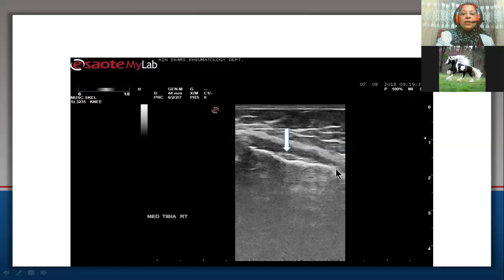On musculoskeletal examination of her upper medial tibia, there was severe tenderness on sonopalpation, together with appearance of periosteal elevation, which may point to the presence of periosteal avulsion in this female with systemic lupus erythematosus, or even presence of periostitis with or without underlying osteomyelitis in this systemic lupus patient taking a large dose of steroid.